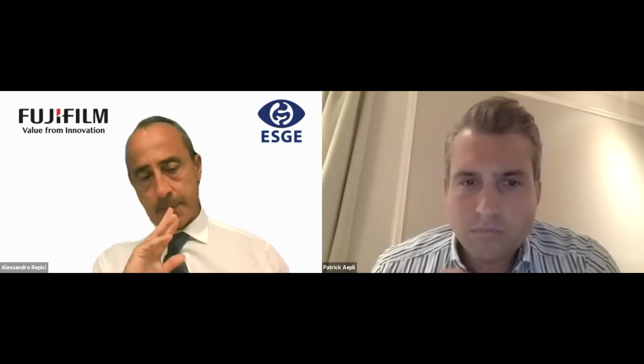That's a good point. So we are using it more and more. It's a matter of technique. If you're using it properly, you're flattening all folds, especially in the areas where the colon is very big. It's difficult to flatten with the tip of the scope. So it's going to show us a lot of tiny and flat lesions that you normally miss. In combination with retroflexion into the right colon, I do suggest that using this kind of technology is significantly improving your ADR and also contributing to keep it very high.